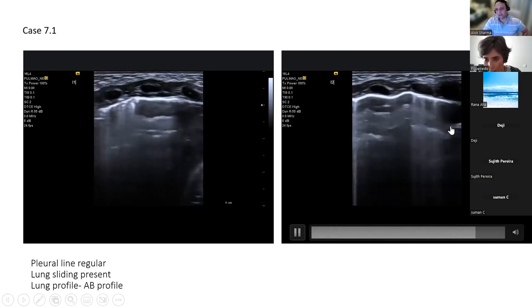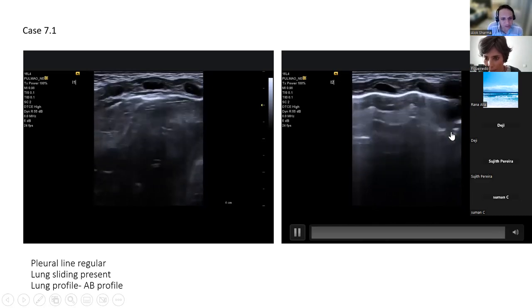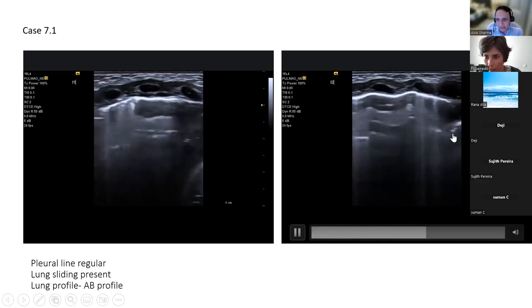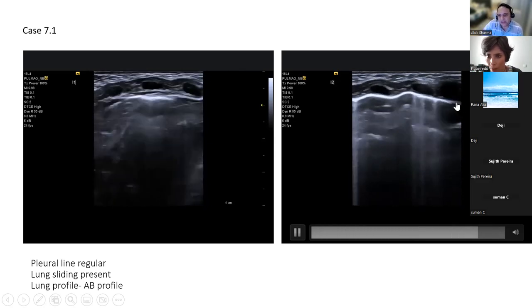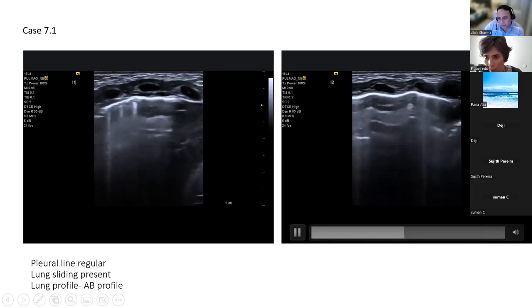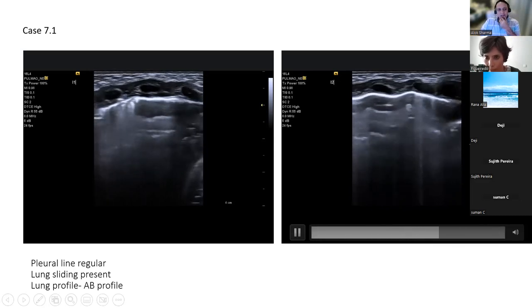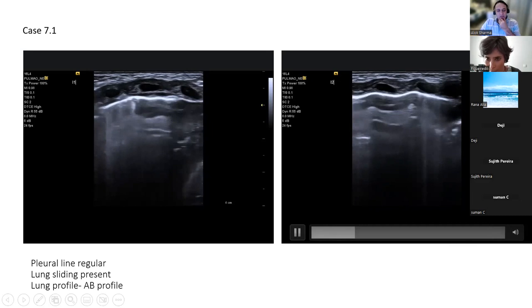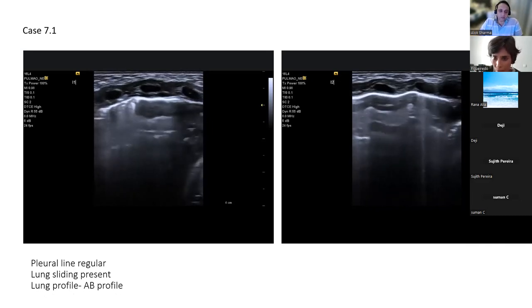It's difficult to say, but the focus at this particular point is at the right place, as I can see on your margins. You get very good pleura. If you want to see deeper regions, you can sometimes drop your focus down a little bit. You've got the right depth and the right frequency for a term baby. Nice images, enough for me to definitely make an interpretation.